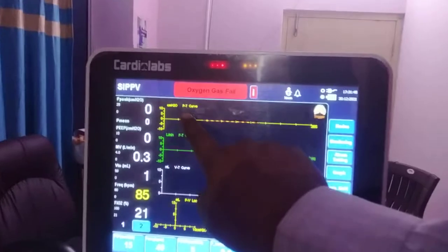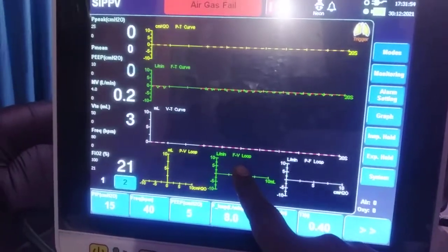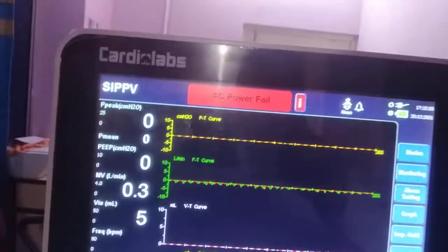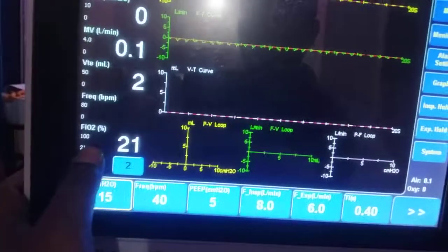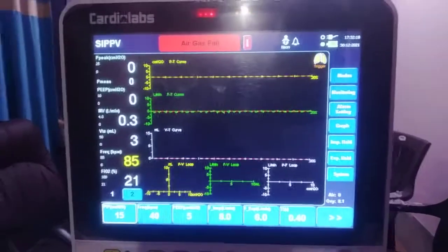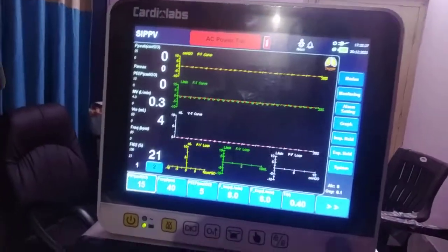Now starting ventilation: in this window you will find a pressure-time curve, a flow-time curve, a volume-time curve, as well as a PV loop, FV loop, and PF loop — three loops and three curves are on screen simultaneously. Monitoring parameters are also displayed on screen. It is very important to have a good monitoring display so the clinician can see what the patient is receiving and what patient effort exists, all in one screen.